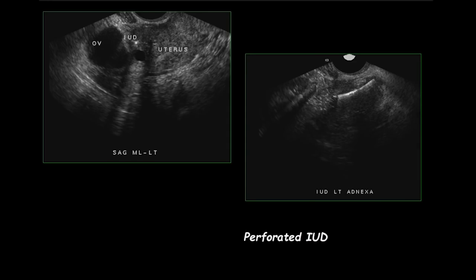This transvaginal ultrasound was performed in a patient in whom the IUD string was not visualized. The IUD was not visualized in the endometrial cavity. The upper left image demonstrates an echogenic focus seen between the left ovary and the uterus. The right-sided image was performed to evaluate the echogenic focus. By rotating 90 degrees and scanning the adnexal region, a linear echogenic structure representing the IUD is seen extending from the uterine serosa into the left parametrium. This IUD had perforated through the left uterine wall.